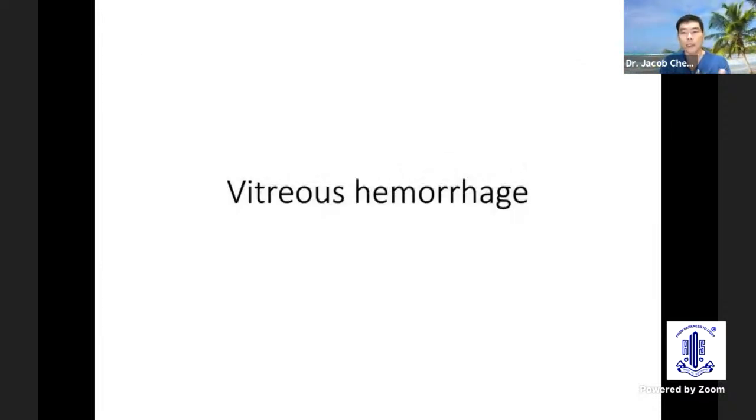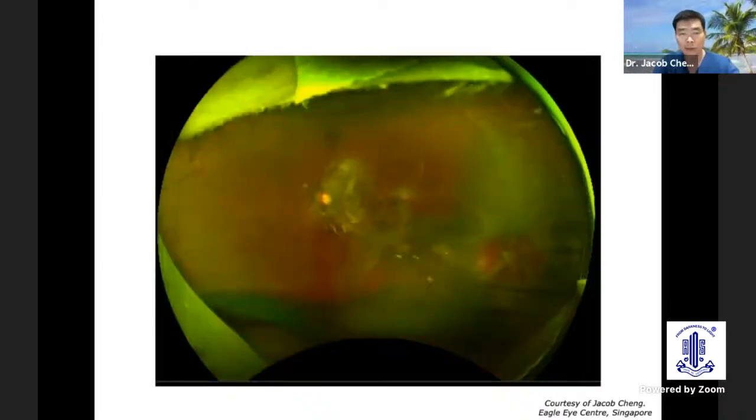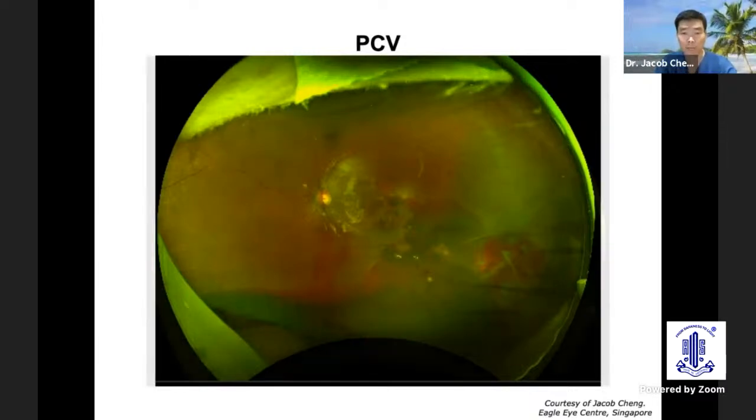Last but not least, I just want to have some examples of vitreous hemorrhage. Typical example of a patient with dense vitreous hemorrhage, with surgery to evacuate the vitreous hemorrhage. This patient has PCV, very common over this part of the world, polypoidal choroidal vasculopathy, evidenced by the huge peripheral subretinal as well as retinal hemorrhage in the periphery.